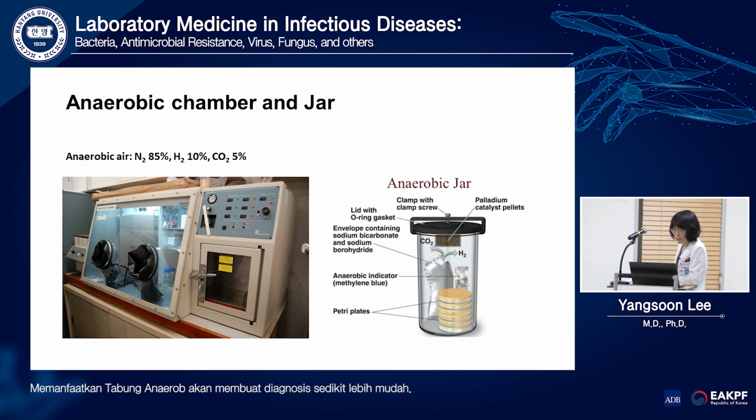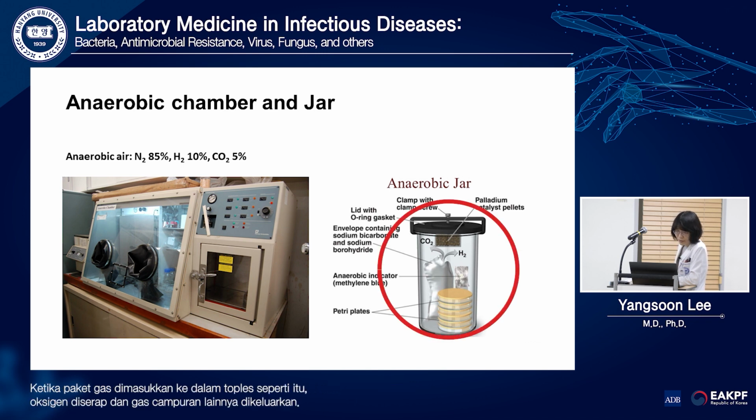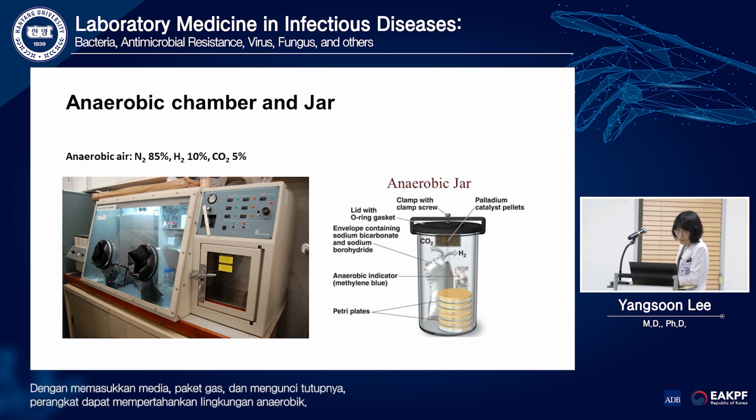Utilizing the anaerobic jar will make diagnosis a little easier. When a gas pack is put into such a jar, oxygen is absorbed and other mixed gases are released. By inserting a medium and a gas pack and locking the lid, the device maintains an anaerobic environment.